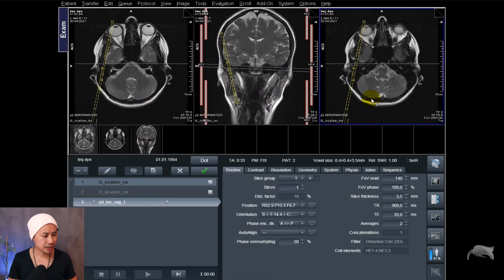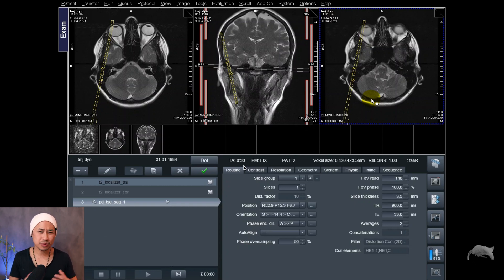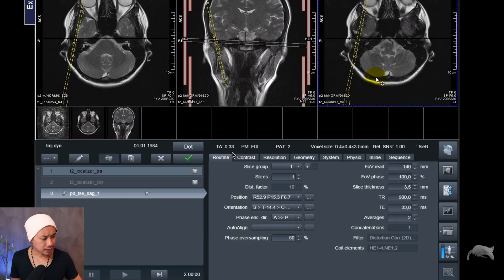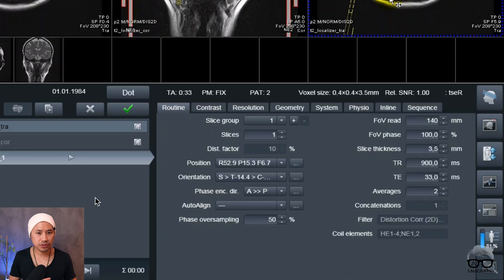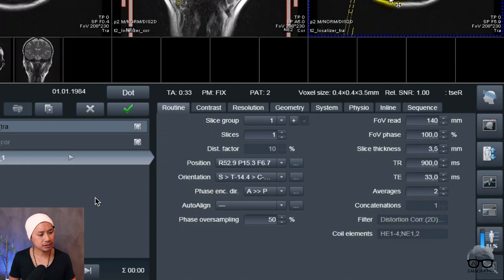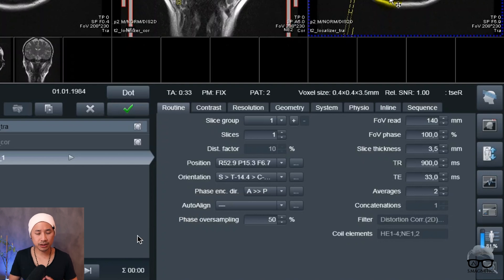In front of you here, you can see I already did a coronal localizer and transversal localizer. The sequence I have in front of me here takes around 33 seconds. So how am I supposed to do a dynamic when it takes around 33 seconds? I'll show you pretty soon. The weighting of the sequence is some kind of a hybrid — something I made to check this approach. With these settings I find that the meniscus comes clearly and you can see the movement, so that's why I'm choosing these parameters. But of course there are many ways to get to the goal. I just call this a PD.